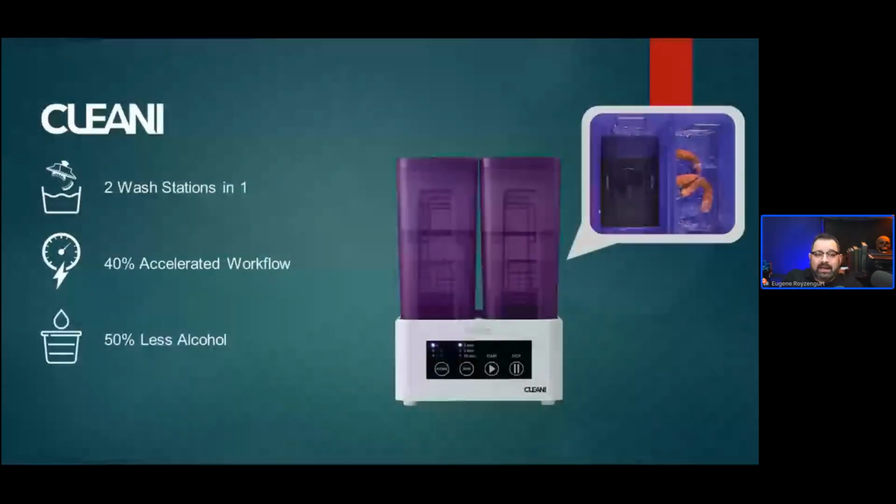This is my favorite. The CLEANI is a cleaning station for alcohol they use after you've printed everything. You need to put it into alcohol and clean it. I usually run about 3 minutes on each cycle. So there's a dirty and a clean. You put it in the dirty one first, and you run it for 3 minutes, and the whole build plate from the Acuretta Soul fits in there. So I don't have to remove the prints from the build plate before putting it in there.